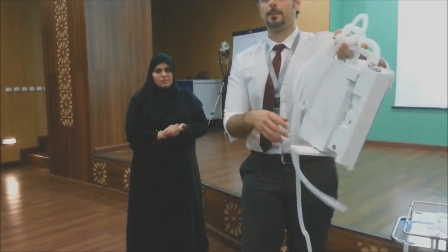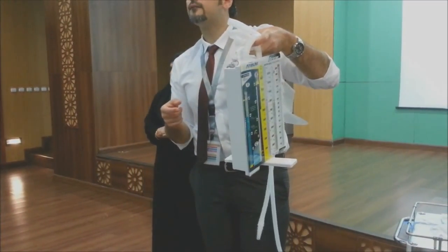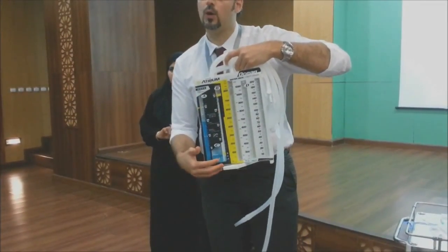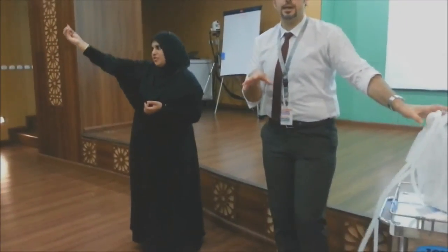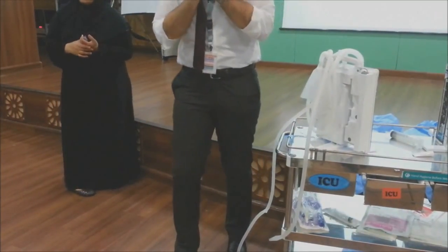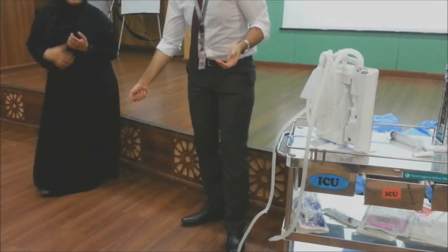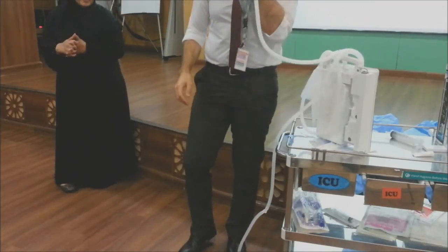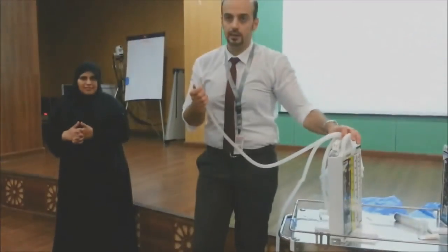In the water seal, what do we put, if the water level is below or above 2 centimeters? That's a very good question. This is designed by gravity. It's 2 centimeters of H2O. With a meter and a half below the patient, the air will come out easily, like what I'm doing, and the air will not come hardly into the patient.